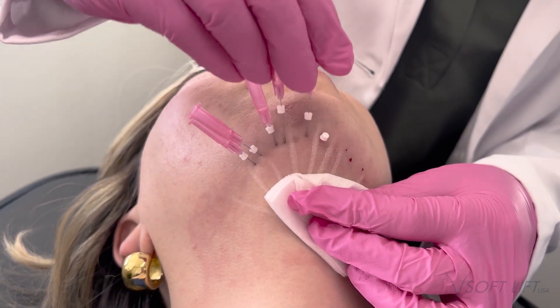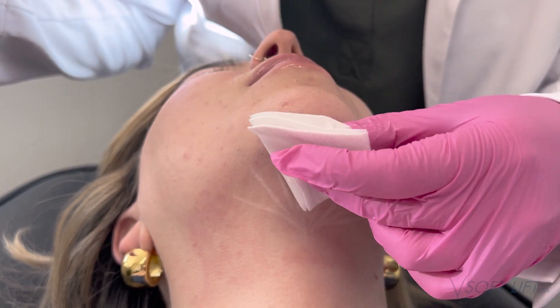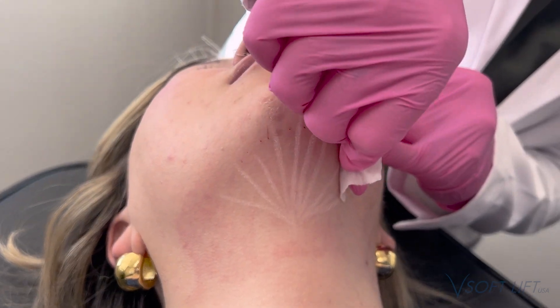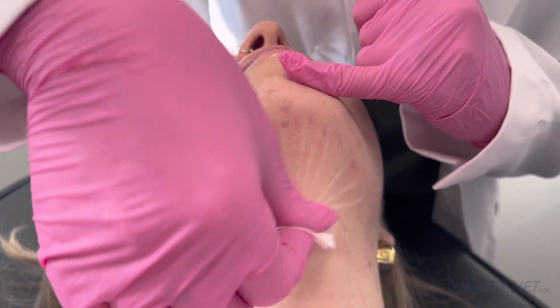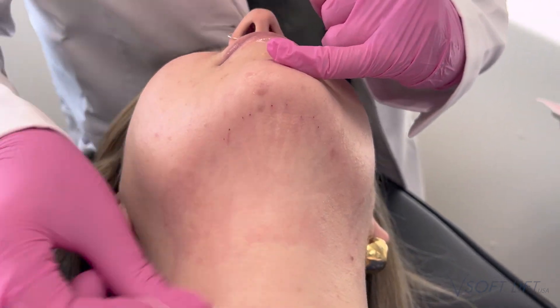Final results will be four to six weeks after that last treatment. So this is not a treatment for someone who is not very patient. It depends on what your patient's goals are — if they're looking for something immediate, this is not for them. But if they're willing to wait, these are lasting results. We're not only getting that lipolysis, but that collagen stimulation as well to tighten the submental area.